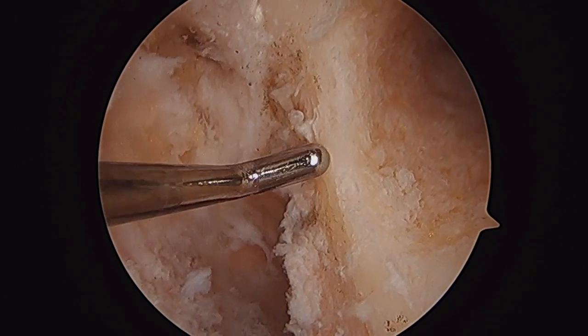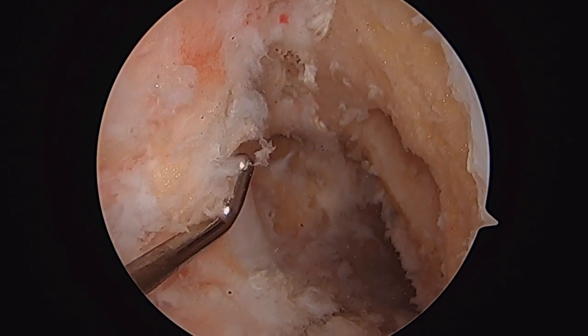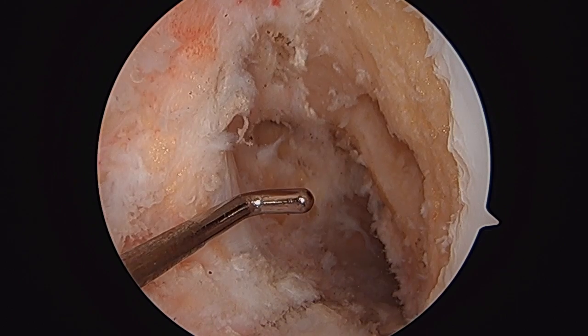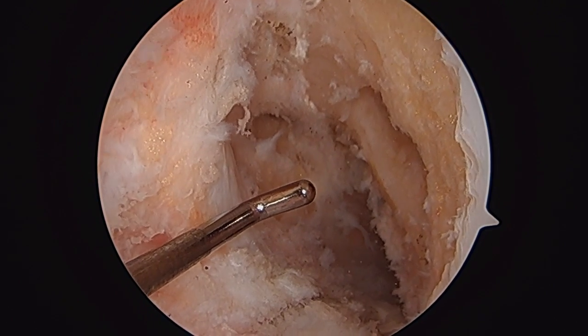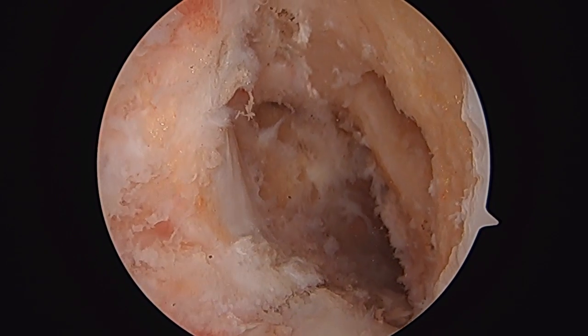Some people might place this tunnel a little further down. I like this position. You can see 12 o'clock. You can see this is probably 2 to 2:30. I kind of shoot for the 2:30 position, not a truly radical 3 o'clock position, but more of a 2:30 position.